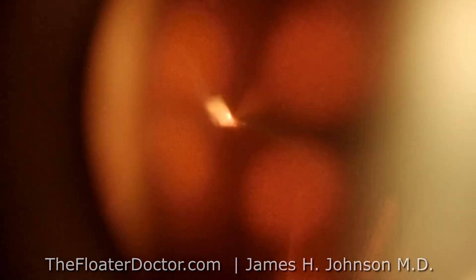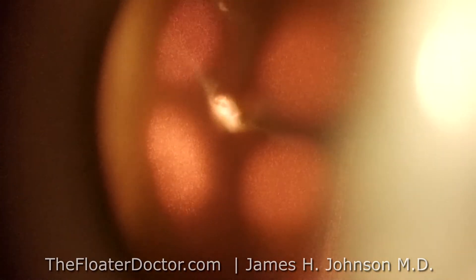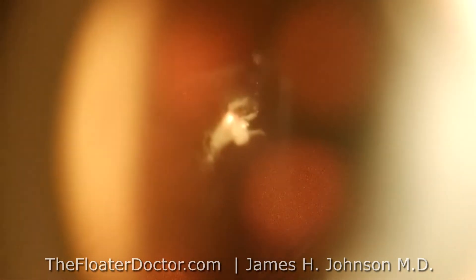This density here is casting a really distinct shadow. What doesn't show up well on camera are these two red beams I use to confirm my focus. I focus those on the front surface and fire the laser — boom, there's our first shot. You can see it kind of dance around and start to break up. There's a lot of movement, so each shot I have to kind of chase it down again.